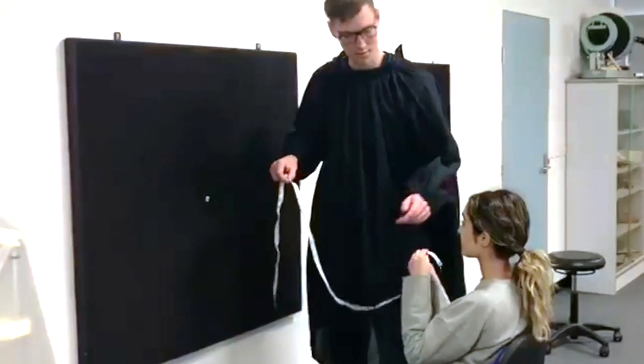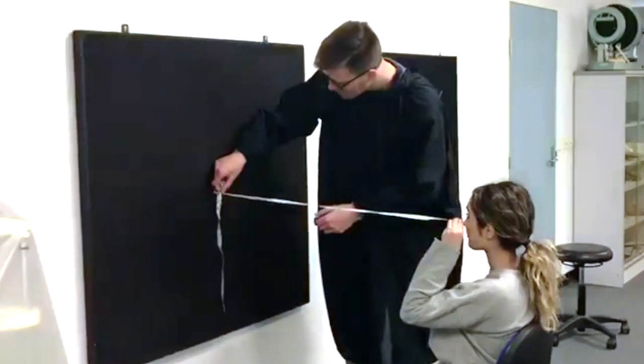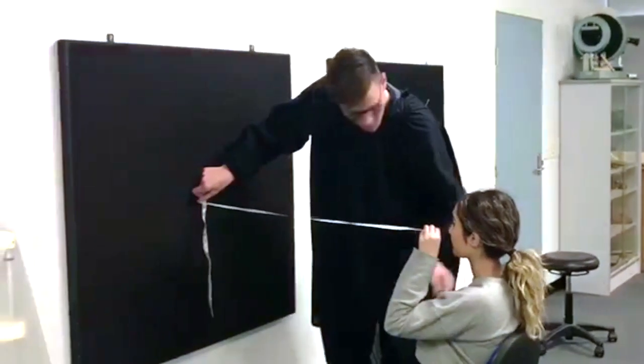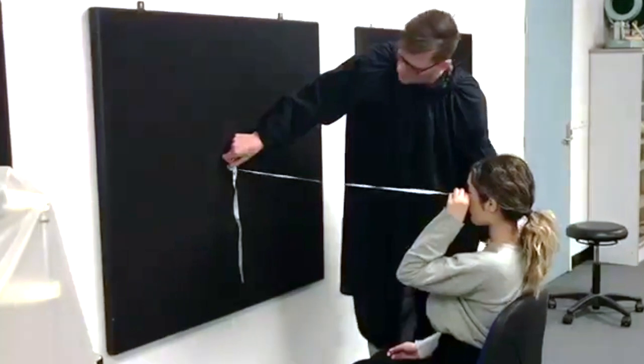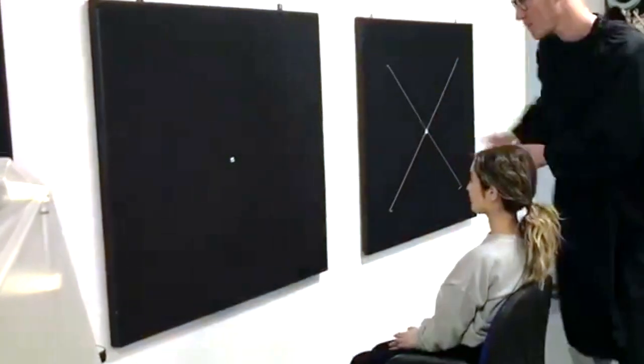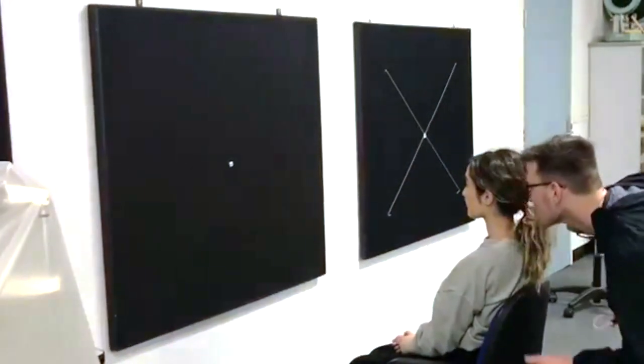Here the orthoptist is using a measuring tape to ensure that the patient is one metre from the chart. The patient is asked to hold the end of the measuring tape to their eye to ensure that their line of sight is in line with the central fixation target.